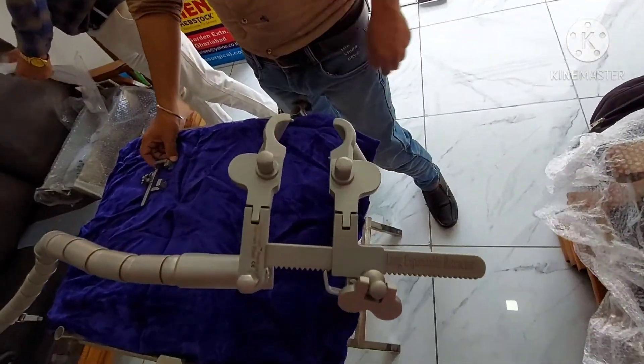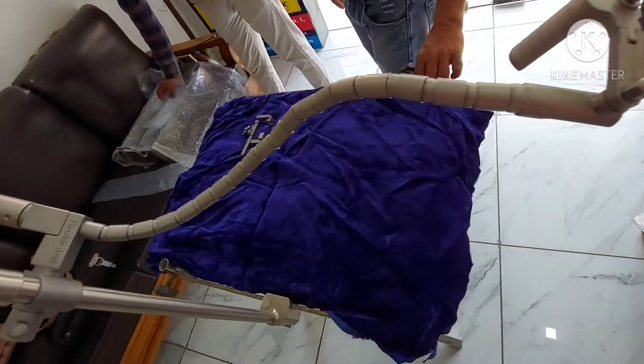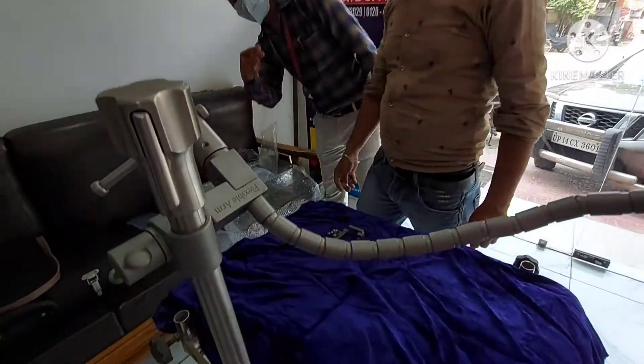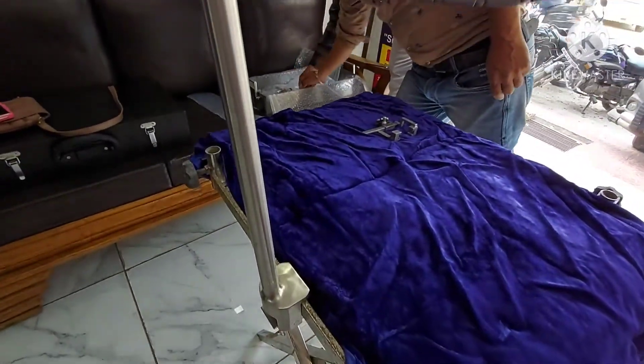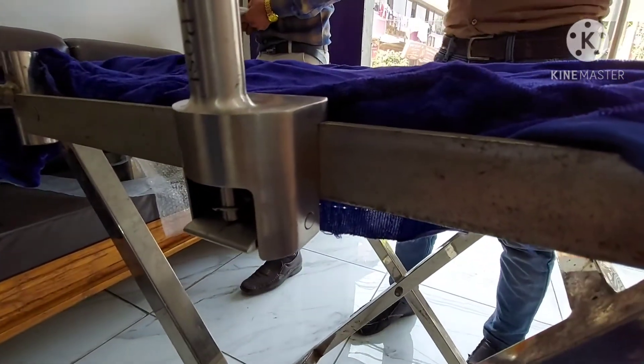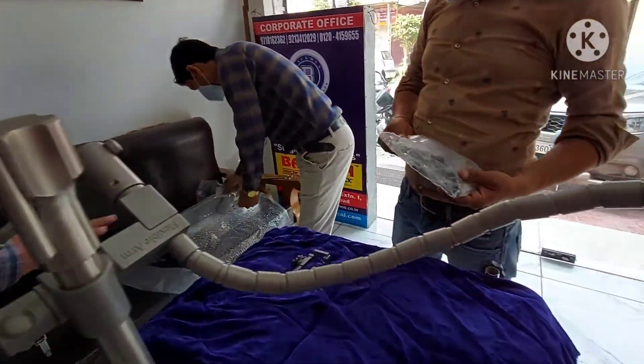All 3 sizes are available in 4 types of lengths: 50 mm, 60 mm, 70 mm, and 80 mm. So in total, 12 retractors will be supplied to you. Along with this, medial lateral retractors will also be supplied, which will have 8 interchangeable blades.